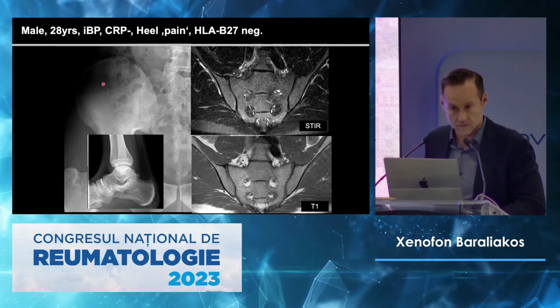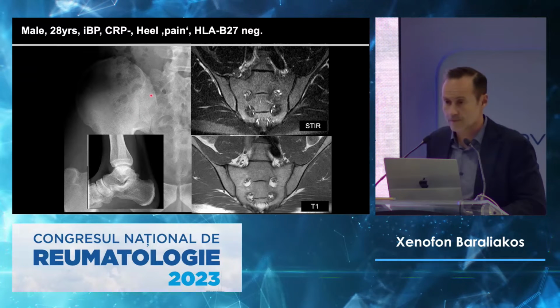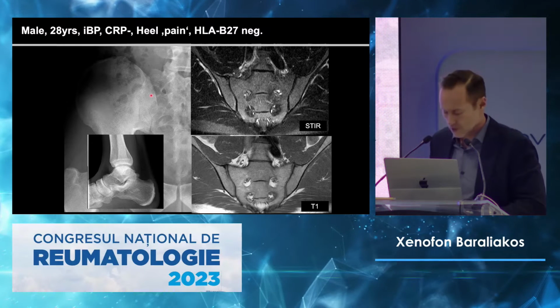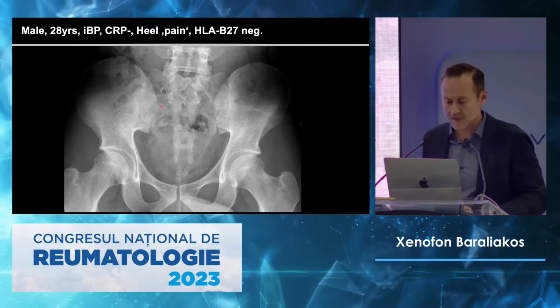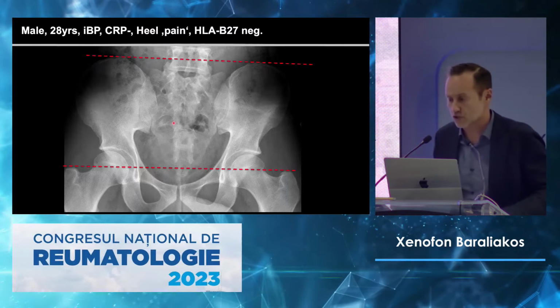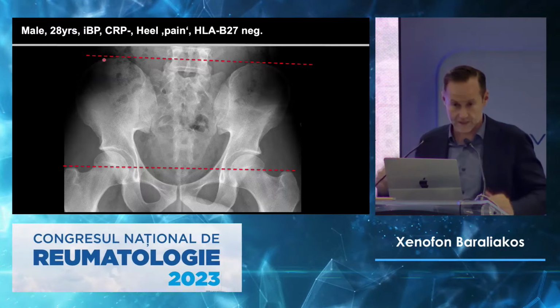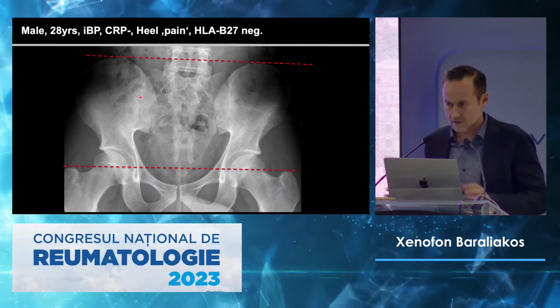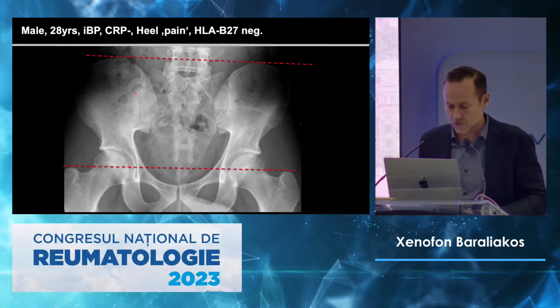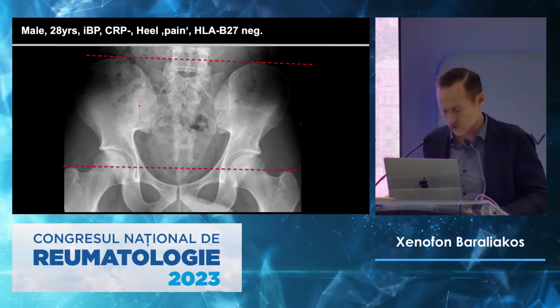Nothing. So the question is, where does that sacroiliac joint damage come from in an otherwise healthy person? Well, the problem is, as I mentioned before, how you do the X-ray. That person was having his X-rays done in a standing position, and you see already here there is a discrepancy of the length of the legs, which makes the tilt different. This means the right sacroiliac joint comes to the front, and that's why you have an overlay. This is a totally normal joint, but the X-ray doesn't show you what is happening.